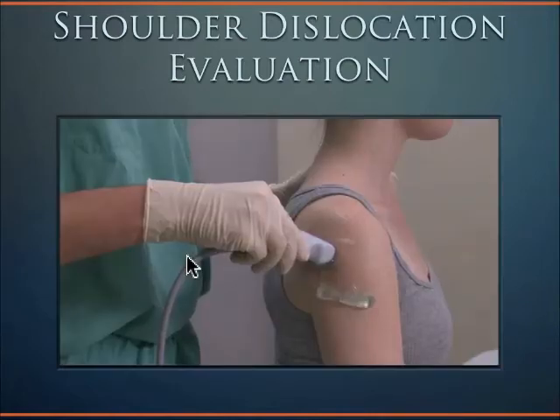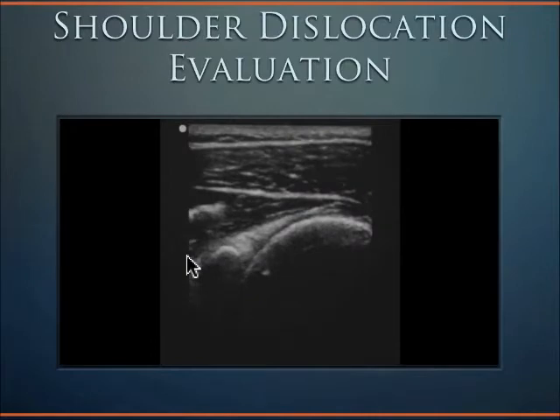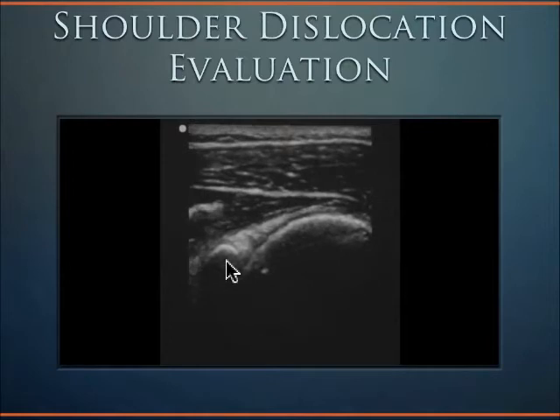This is the bony segment that articulates with the humerus to form the shoulder joint. Keep the probe in a transverse axis at all times, as this will provide the appropriate view. Obtain a nice view of the humeral head and the glenoid on the left — humeral head and glenoid.